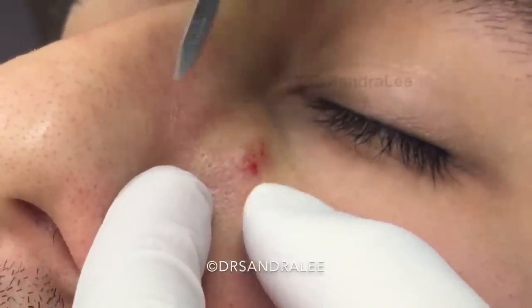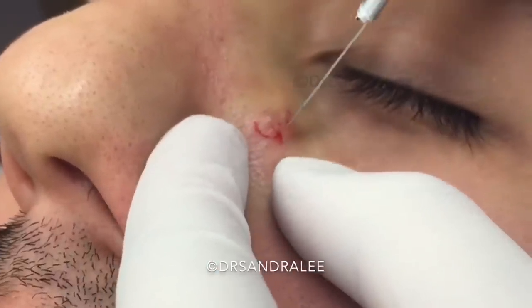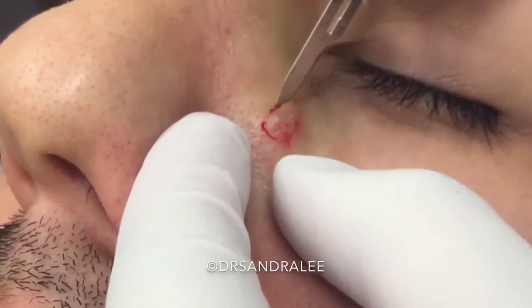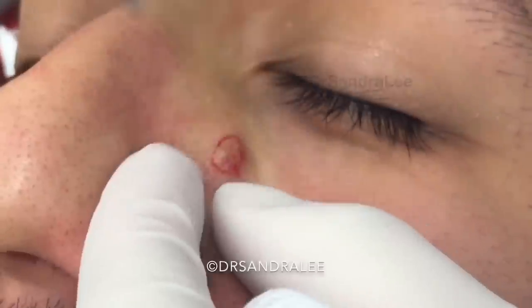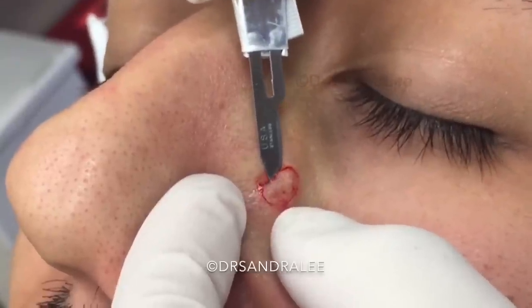I just want to take it off as nice and flat as I can, so I kind of just take my time with you. Are you feeling a pinch? No, no, I don't know what's going on. Well, we're just taking a little time. I'm just going to stretch your skin so we can try to get this off as nice and flat as we can.